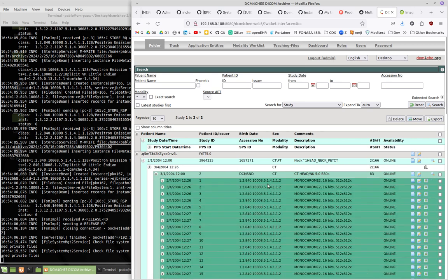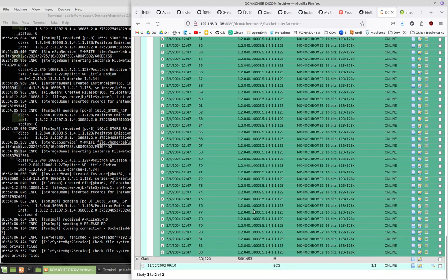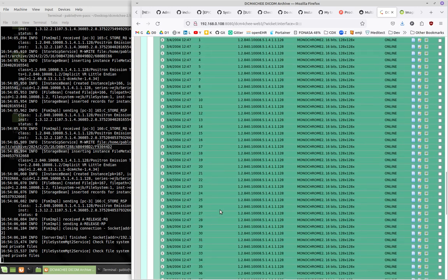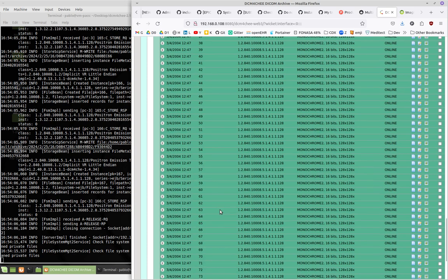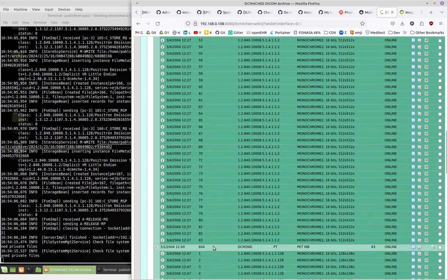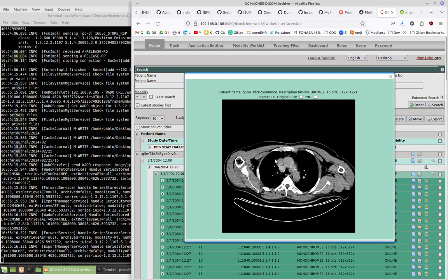Let's see, I think it's more than 166. Yeah, there are 83 there, and there are 83. Oh, it's 166. Yeah, we have two series of 83 images. Here we can see individual images, I hope. Yeah.